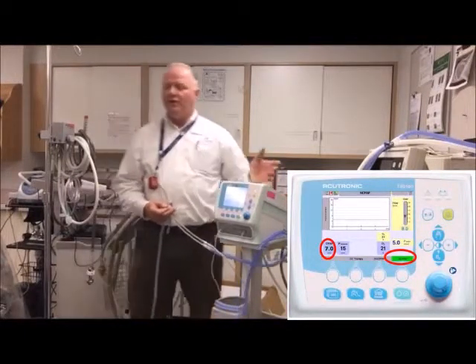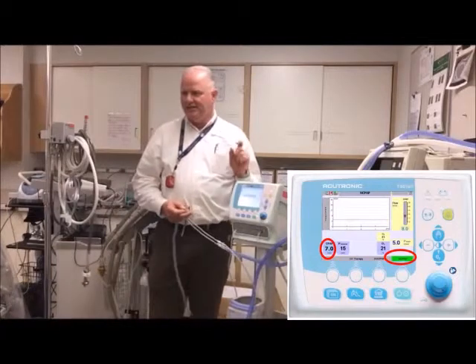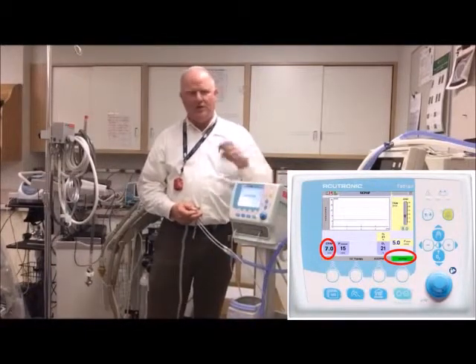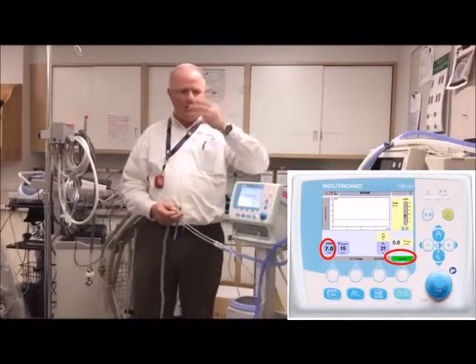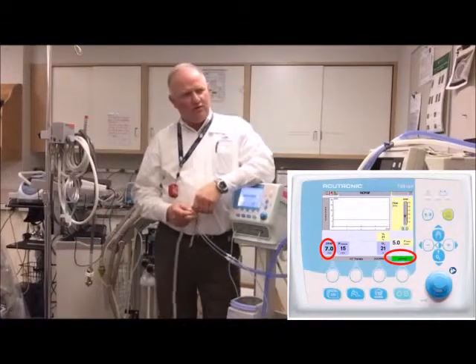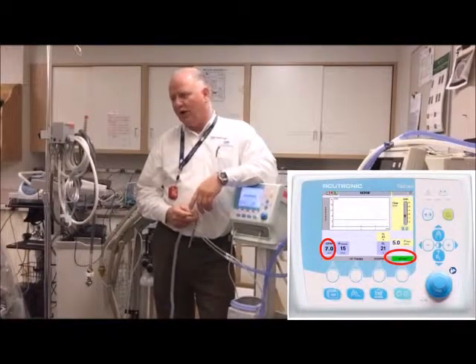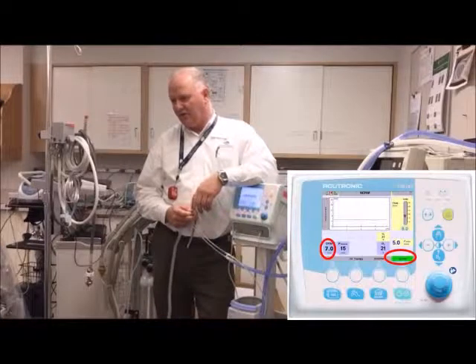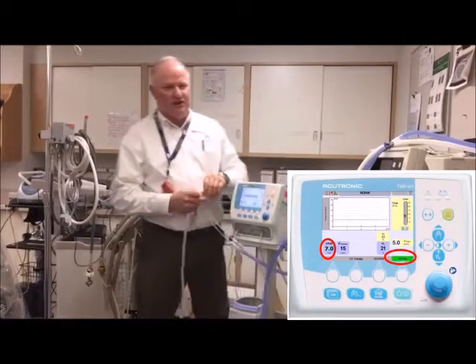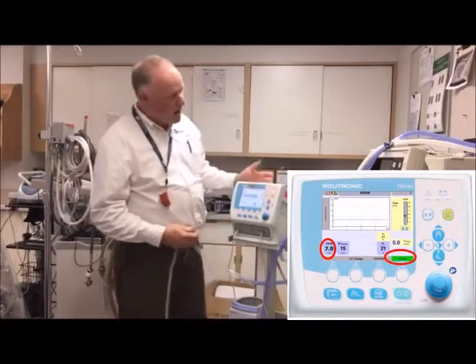It will compensate for up to 40% leak — though that's going to change to 25%. The issue is if you have too much leak, you don't want it to completely compensate. The nice thing is it compensates rather than alarming, so you're not being called constantly to put on chin straps and reposition babies. Studies have shown babies can be disturbed something like 300 times in an hour — we don't want that.